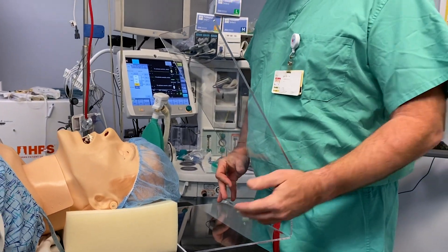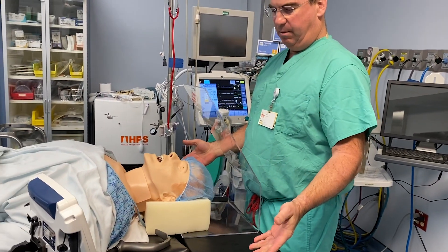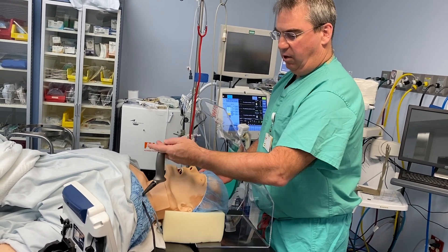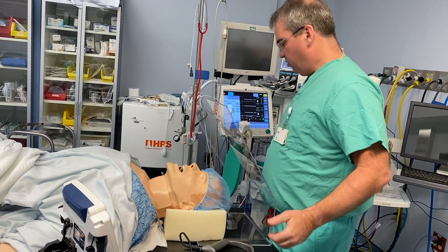The shield can easily be replaced at the top of the head on any OR bed at any time, and it allows manipulation by the provider with their hands in and around the airway. Any laryngoscope of any kind, including direct laryngoscopy, can be used and the provider is protected.